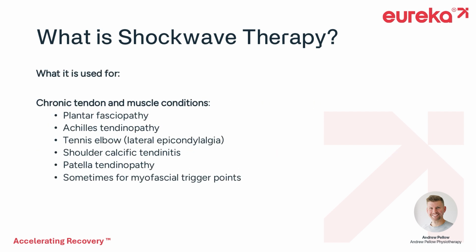Shockwave therapy is commonly used to treat chronic tendon and muscle conditions such as plantar fasciopathy, Achilles tendinopathy, tennis elbow, shoulder calcific tendinitis and rotator cuff related pain, patella tendinopathy, and sometimes for myofascial pain.